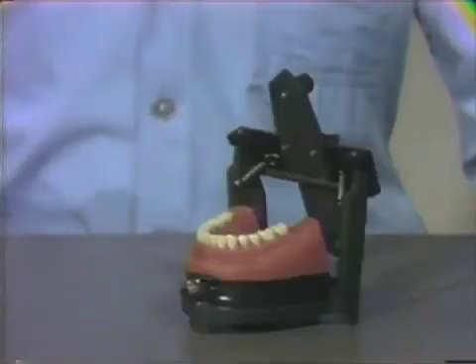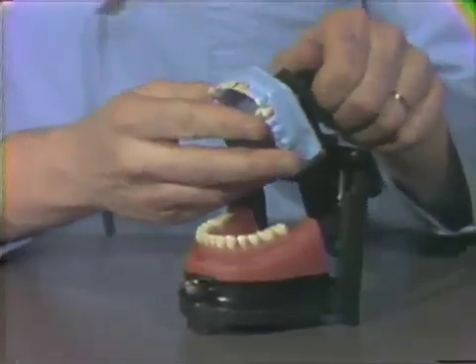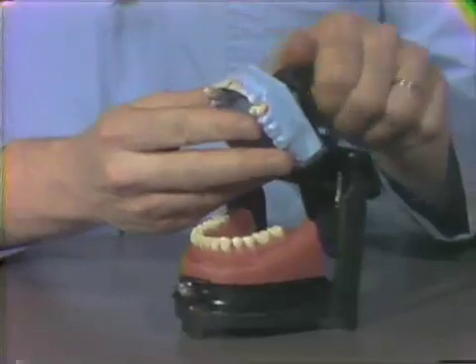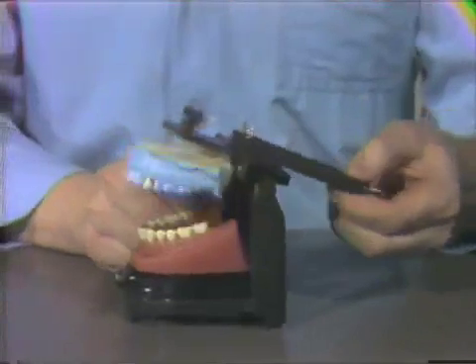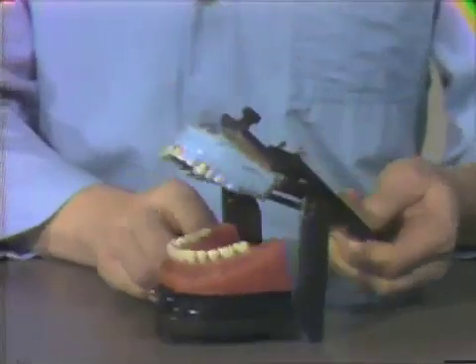This is what you'll see when you're going through the techniques course instrumenting your teeth. Now let's take your completed articulator, mount it back on the typodont, mount it on your chair mount in the normal fashion, and you're all ready to go.